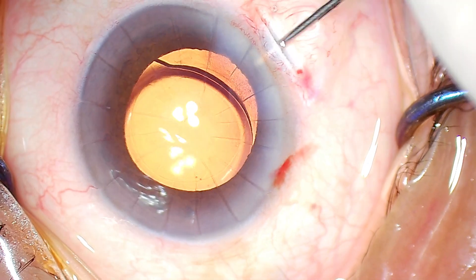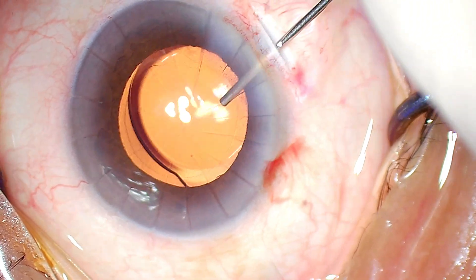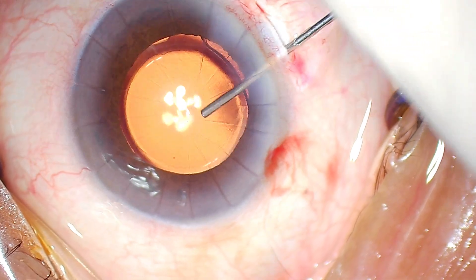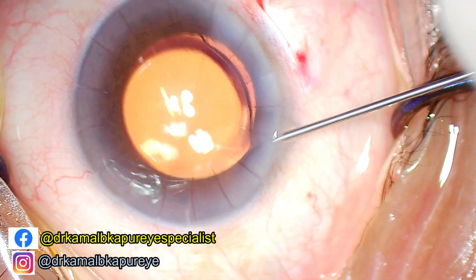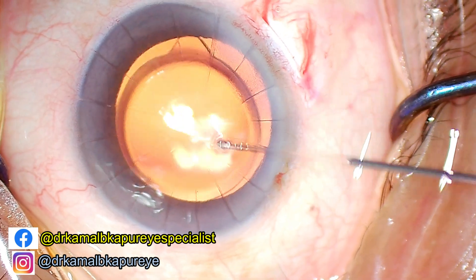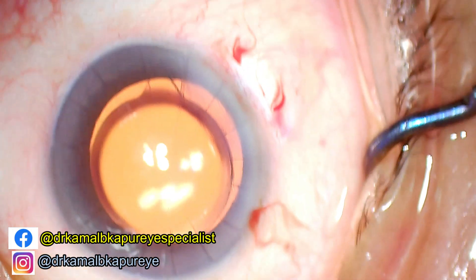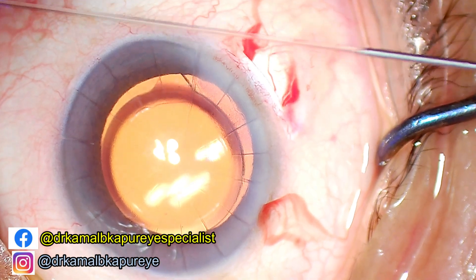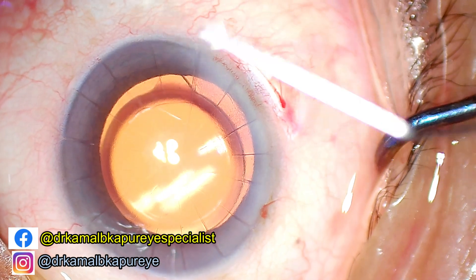Now we clean the posterior capsule and confirm the IOL is perfectly centered. We proceed to see the advantage of creating an L-shaped conjunctival opening, which makes sealing of the conjunctival flaps very easy. Note that I will not hydrate the wounds in this particular case — even if you do, do it very gently, injecting fluid into the cornea to seal the wound. Hydration may again cause the RK cuts to open up.